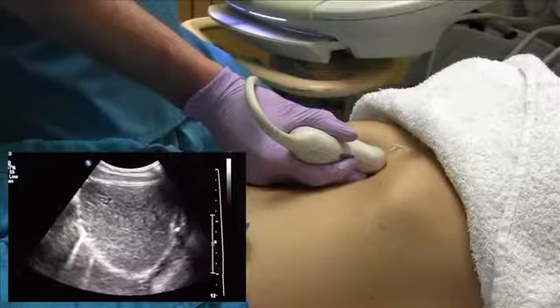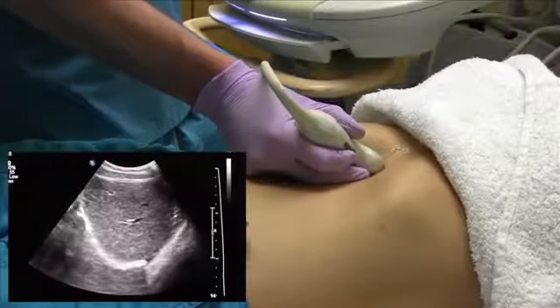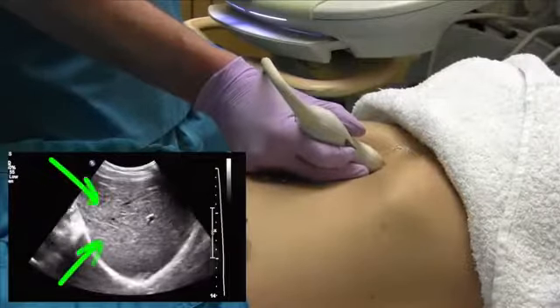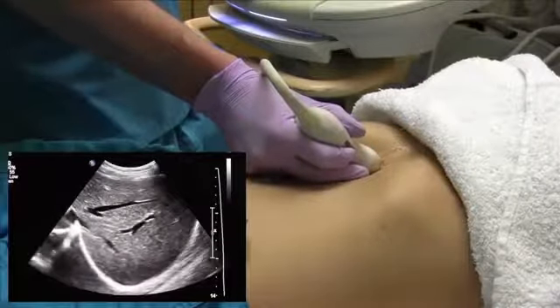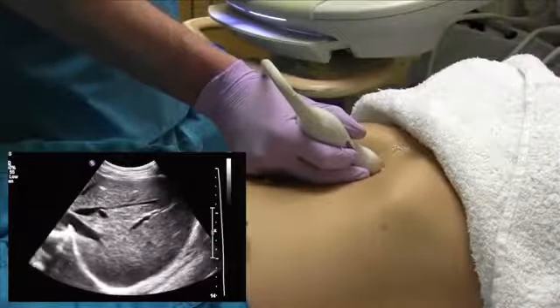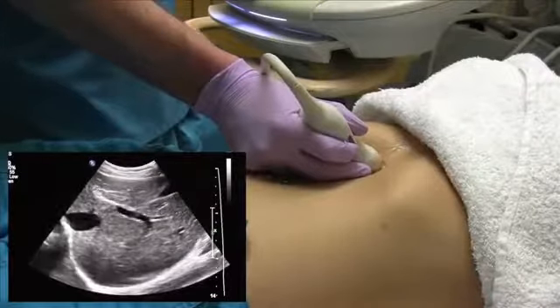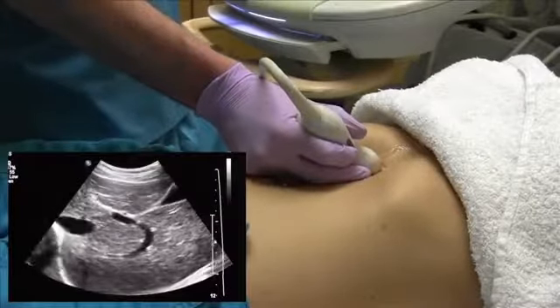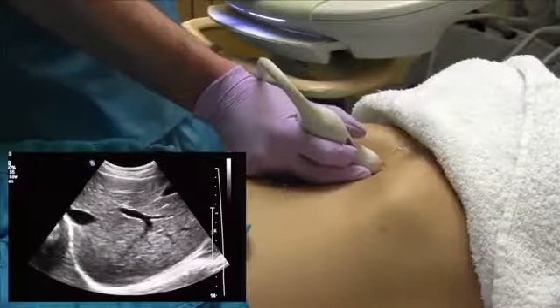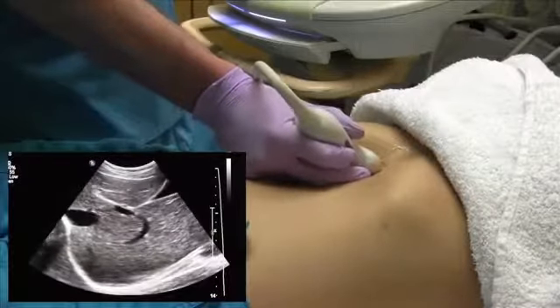You're above all the hepatic veins and portal veins. And then as you come down, you're going to start to see the hepatic veins come into view. The walls of the hepatic veins are less echogenic than the portals, and that's usually a good tip-off that you're seeing the hepatic veins. Besides that, you can also see them obviously go directly into the IVC. And then that's my second picture of the right lobe.